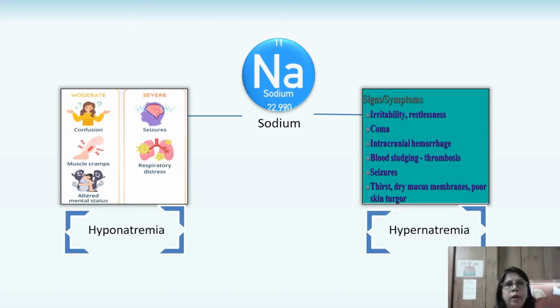Sodium is usually kept at the physiological levels. However, in the use of anticoagulants such as citrate, there are variable levels of sodium in the citrate anticoagulant, and so the sodium level may have to be changed accordingly. Sodium levels may also be prescribed depending on whether the patient has hyponatremia or hypernatremia.